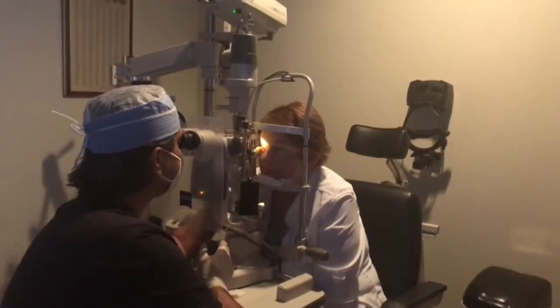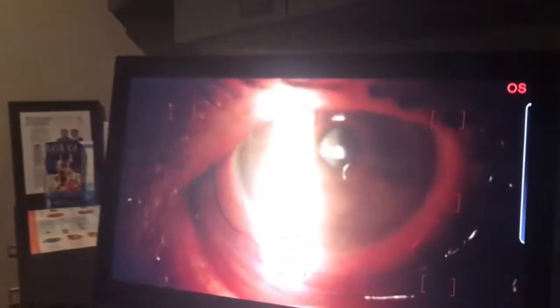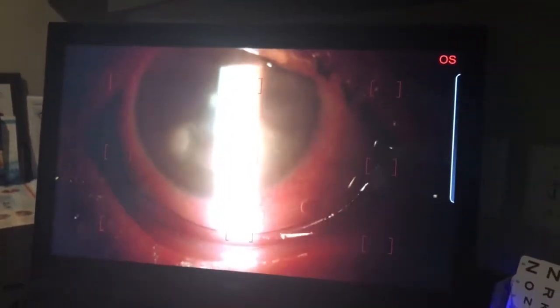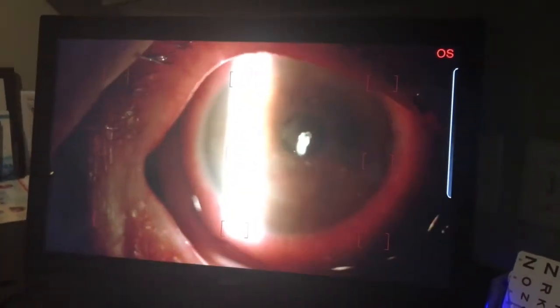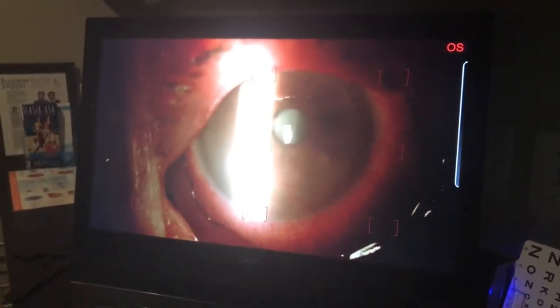We've inserted the Prokera, which is actually a ring. You can see the underside out of the lower lid and the upper lid, and she's very comfortable. If you look at the imaging there, you can see the edge of the ring right here and how it's beautifully covering her cornea. In this case, extremely dry, vascularized with an epithelial defect.